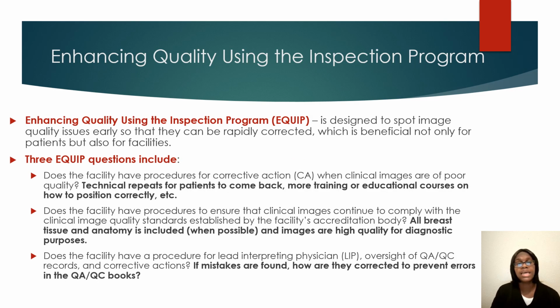Now we're going to talk about enhancing quality using the inspection program. Enhancing Quality Using the Inspection Program, or EQIP, is designed to spot image quality issues early so that they can be corrected, such as motion artifacts or artifacts in general.